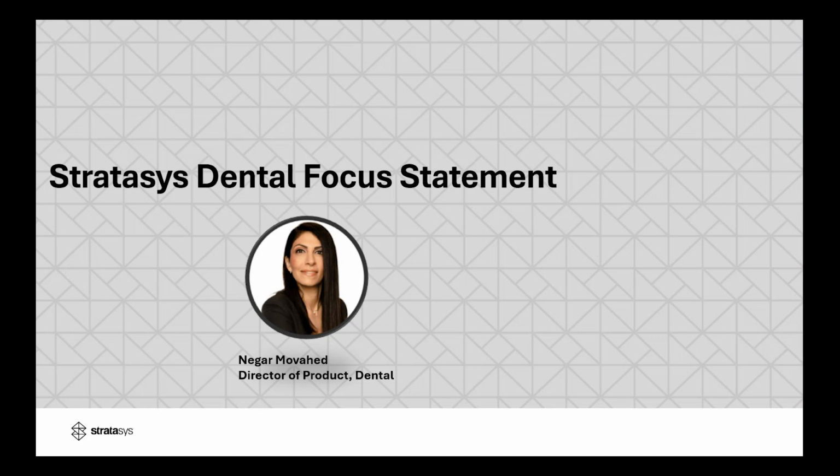Second, it needs to be comfortable to be adopted, and the unmatched fit and accuracy that TrueDent offers addresses the gap that a lot of other digital dentures may have, and especially the gap that traditional workflows have. Third, we built a strong denture solution today, but we've listened to the market as part of our customer-centric approach. We know our next step is to improve our mechanical properties with a high-impact solution, so that's definitely coming.